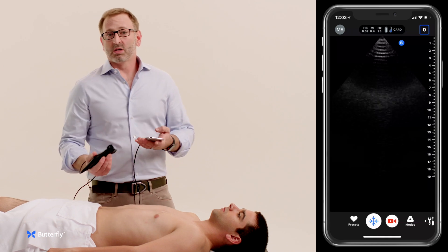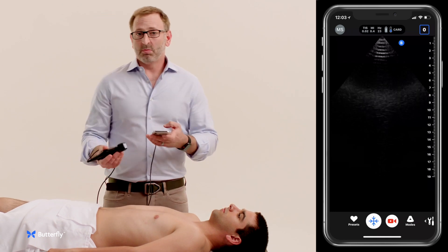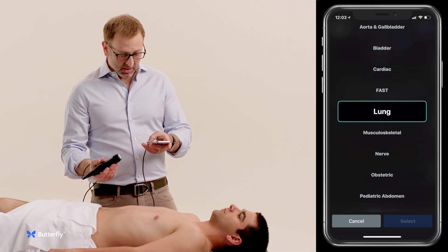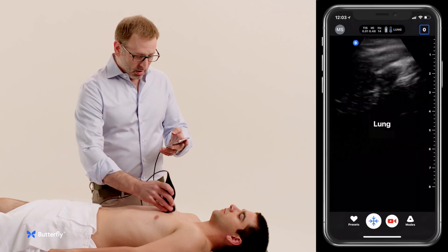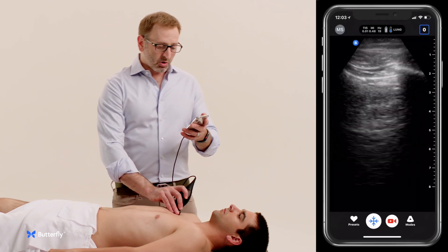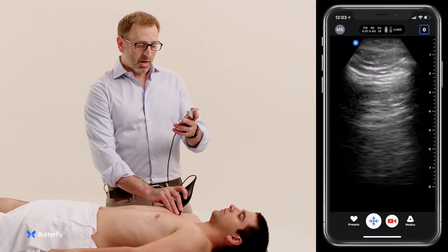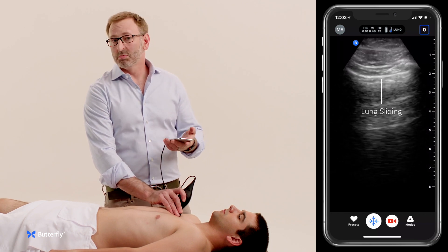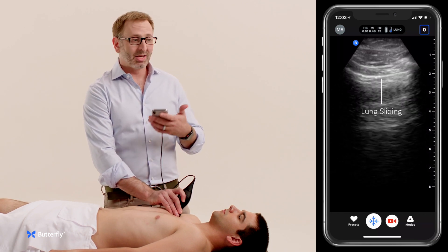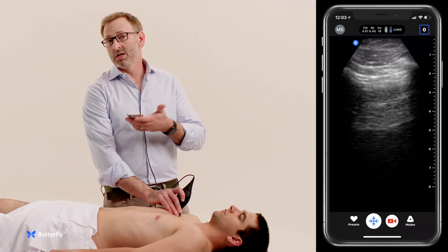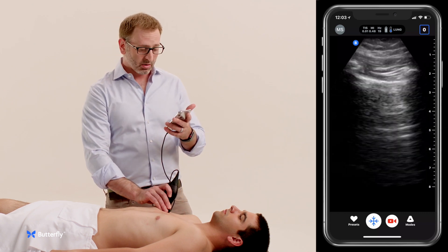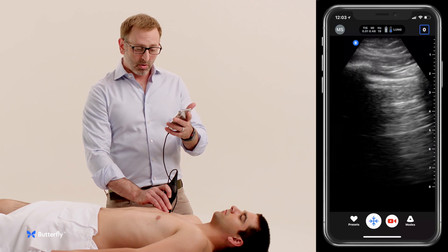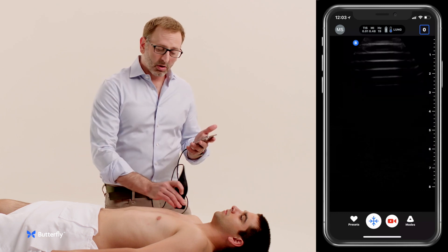We'll then move on to the lungs. Traditionally we'd be changing transducers at this stage, but here we can just go to the lung preset. We'll take a look in the parasternal windows and assess for pneumothorax with lung sliding, and look for A lines versus B lines, which could indicate clear lungs versus congested or fluid-filled lungs. In this case we have an A line pattern, which is normal, with normal lung sliding.